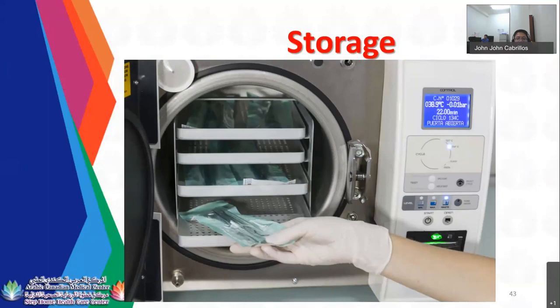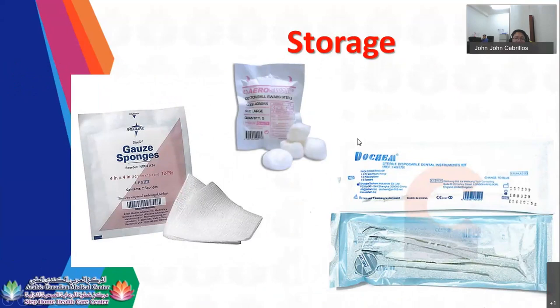So for storage of your different consumables, please be reminded that you need to segregate sterile and clean. For example, there are some sterilized instruments that are purchased outside. So when purchased sterile supplies are received into the facility, you need to immediately store them. Okay, so this is your sample of your sterile packages.